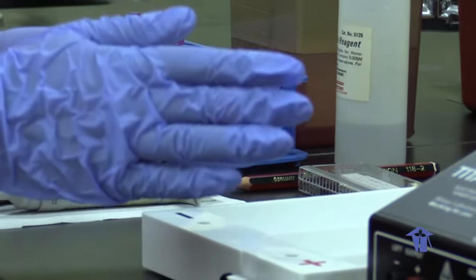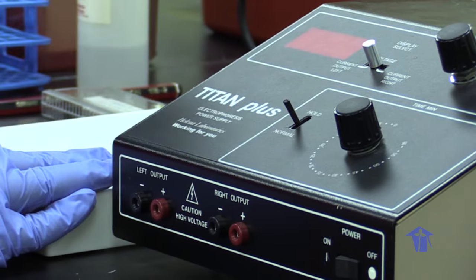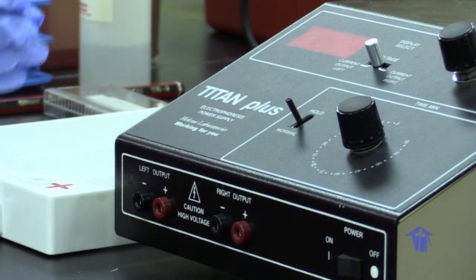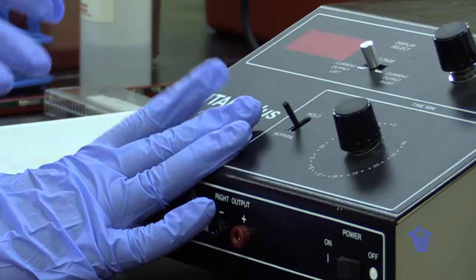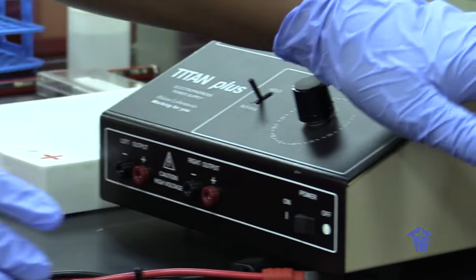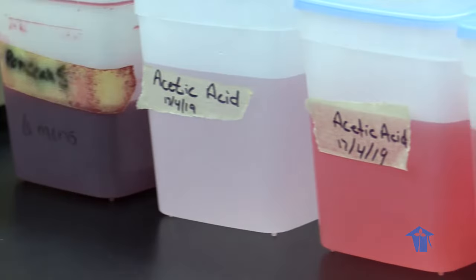Right? We have our chamber that we actually run our plates in. We put our plates in and we get our reaction, whether it's negative or positive, and our bands are pulled in the direction that they are charged by the electrophoresis power supply. Then we have our stains. Right, so that is the process. We set up our sample, we put it in the chamber, and we stain them, then we dry our plates.